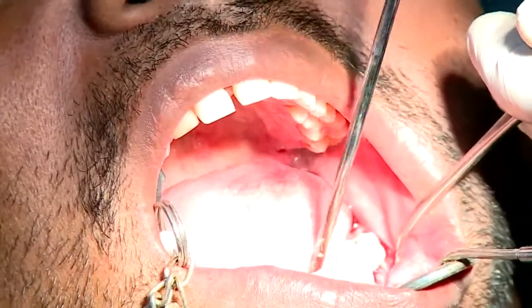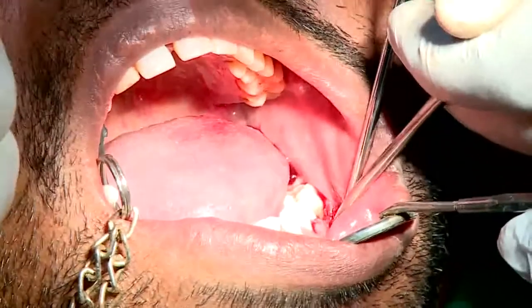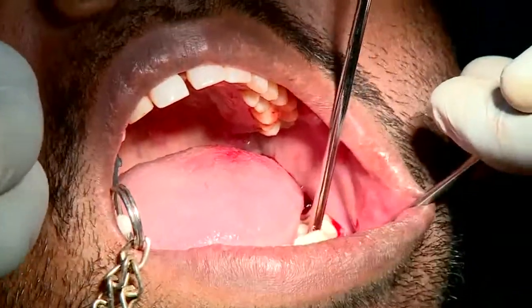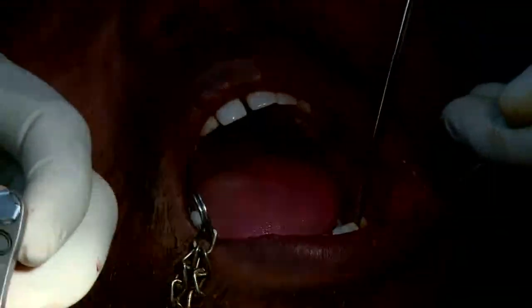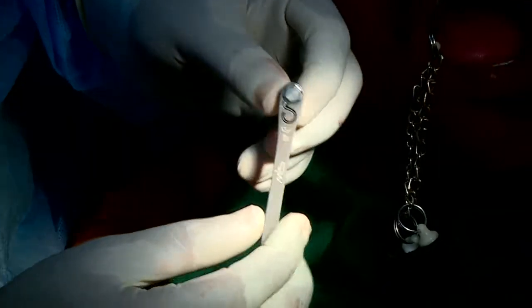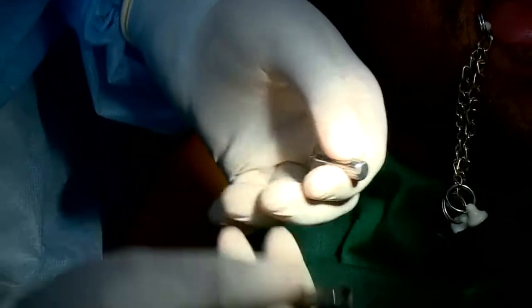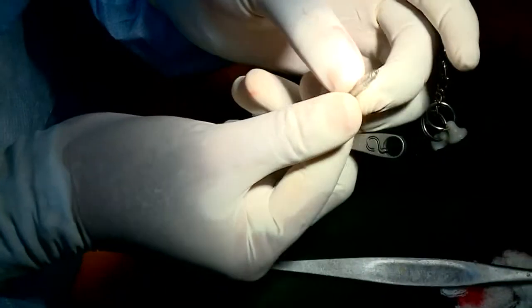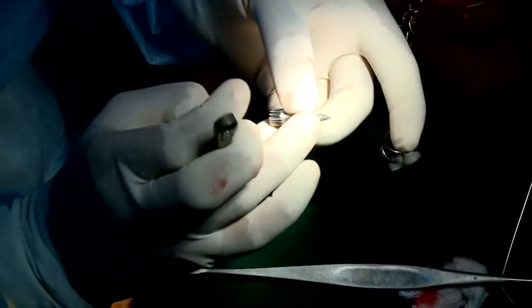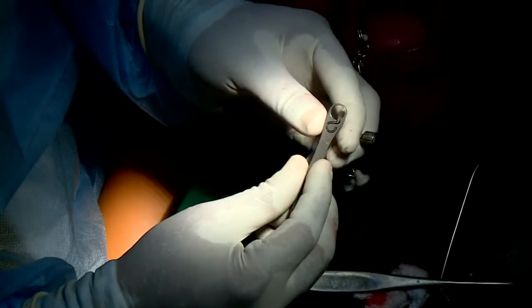Okay, I think I will take the questions later, but see, this is a ratchet. I am going to show the next bit of it. What do I mean by a ratchet? I am sure you would have heard about spanners and screwdrivers. Now, this is what we call an implant driver. This will fit inside the implant head. This ratchet is like a spanner.